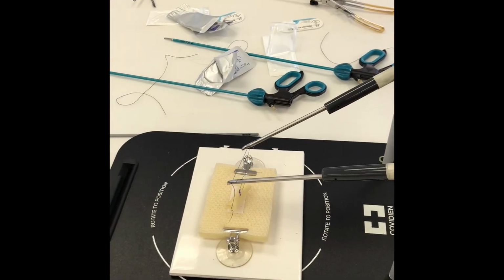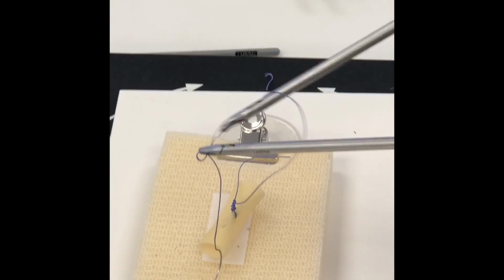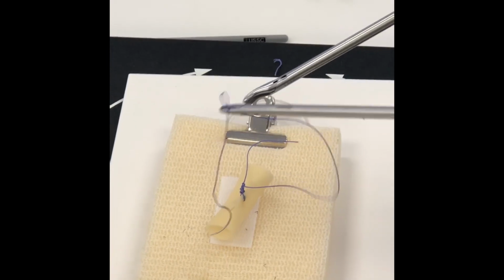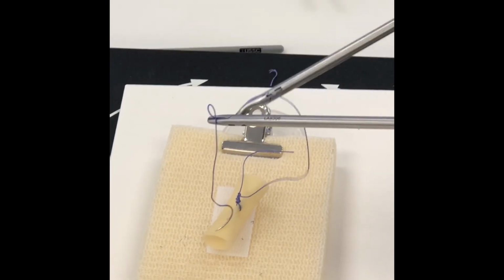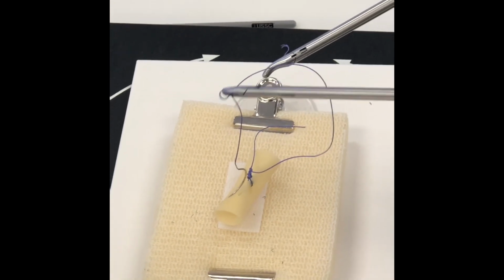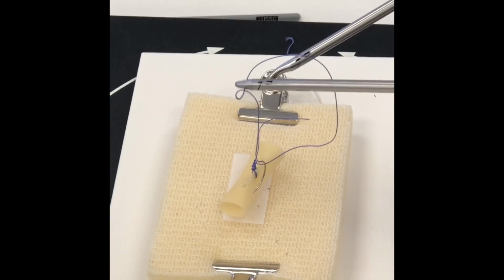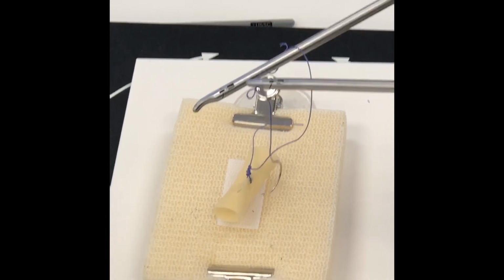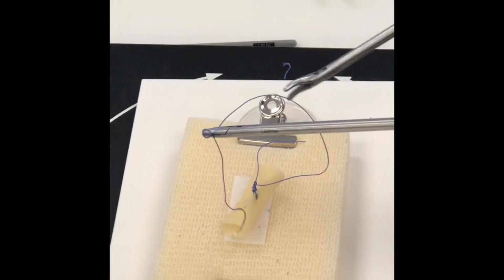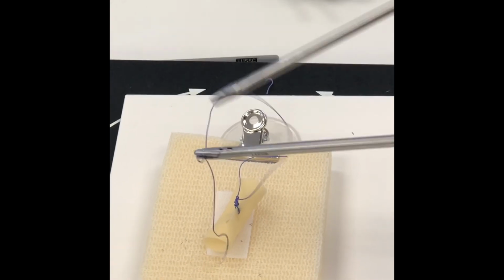Let me show two ways to make it better. One, make your loop bigger. It always gives you a little bit, takes that tension away so you can get into the other thing. Make your P or your B bigger, you mean? Yeah, this loop. The other thing is if I can't get the loop, let's say it's like this, imagine I can't wrap like this. Then I would just rotate my hand this way, my left hand, my non-dominant hand, rotate it to give me a bigger angle, and then I can wrap. So it's always either the loop is too big, or you just need to change the angle with your right hand. That's two, or you need to release the tension. That's three. Okay, that's good.